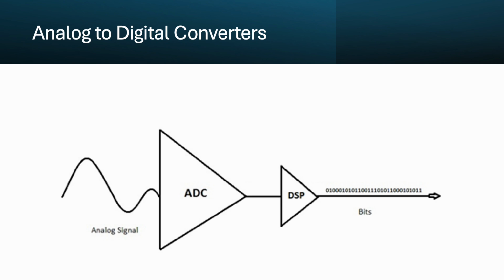So there is a signal artifact because the amplifier is desperately trying to accurately show the signal. Think of it like this. You know when you get a low quality video on YouTube and it's pixelated, meaning the image is blocky? It can sometimes make the video or picture look really different because there isn't enough resolution. That's the same thing with aliasing.